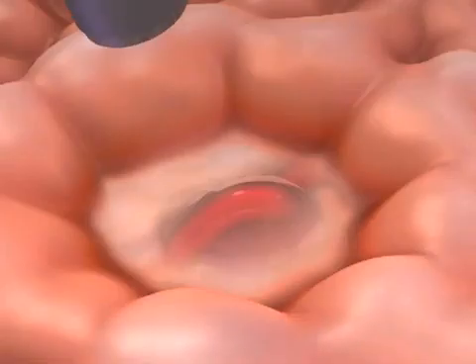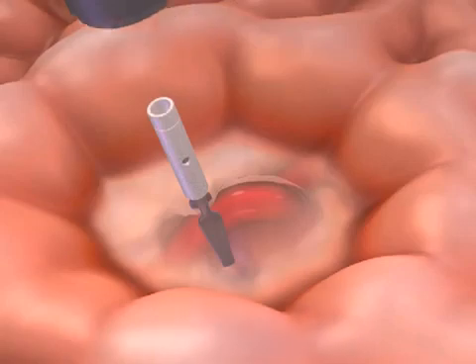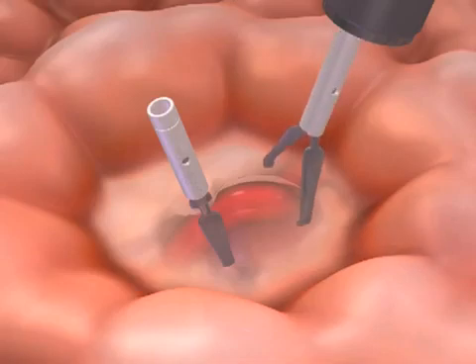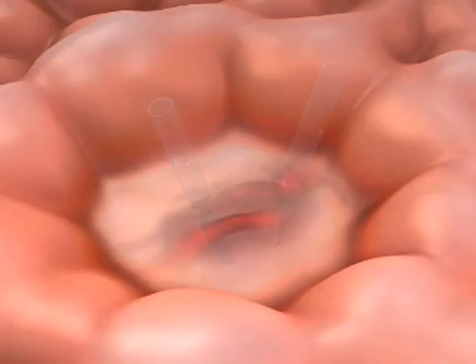At the site of bleeding, a clip is placed directly onto the visible vessel, with caution taken not to amputate the nipple-like projection. Multiple clips can be successfully placed to achieve optimal hemostasis. Care must be taken not to dislodge previously applied clips. As a rule, when optimally placed, the clips should remain in situ for at least 7 to 10 days before sloughing off.